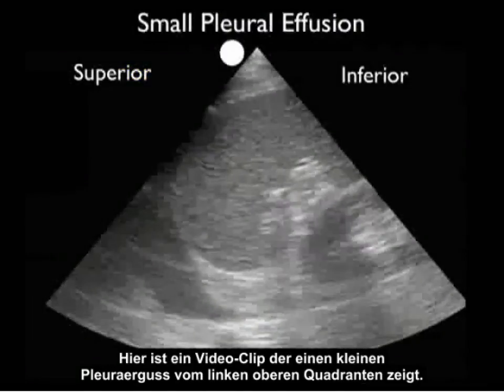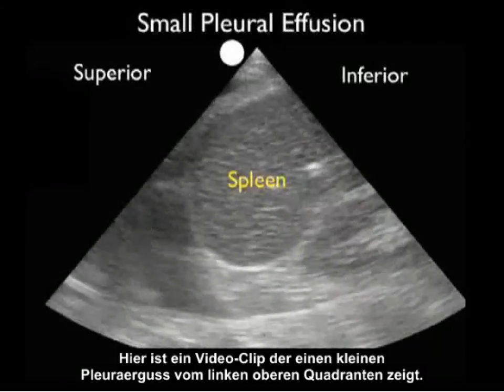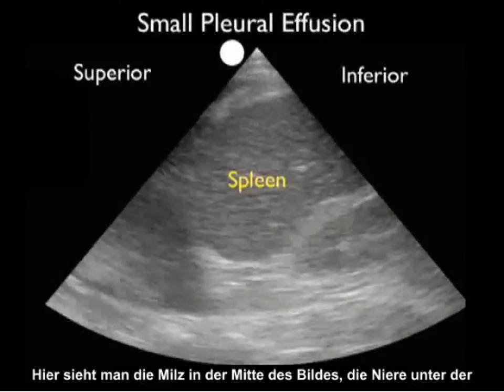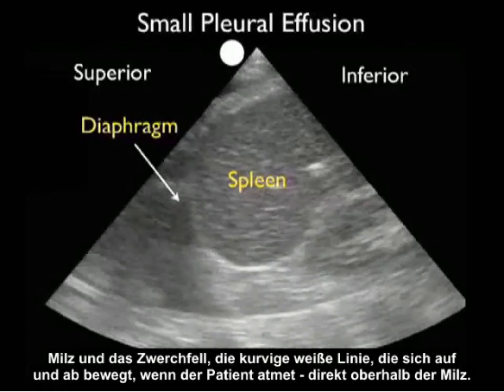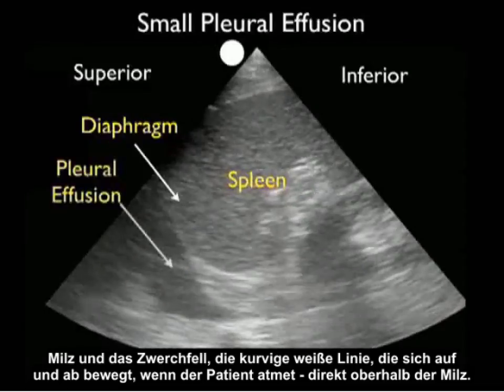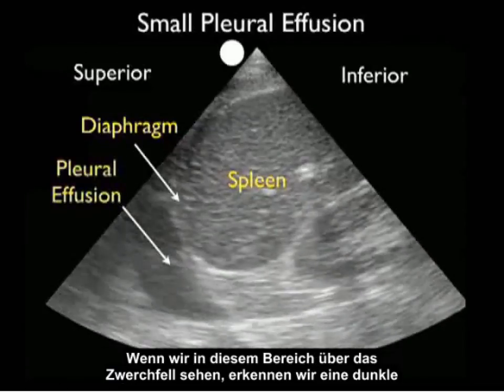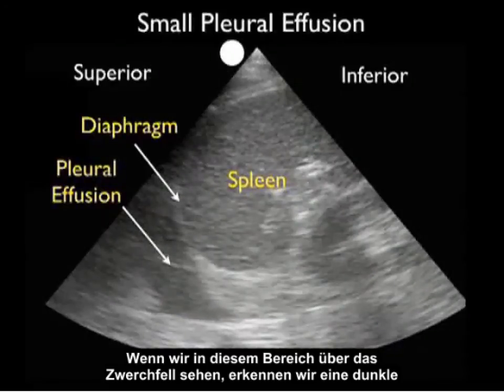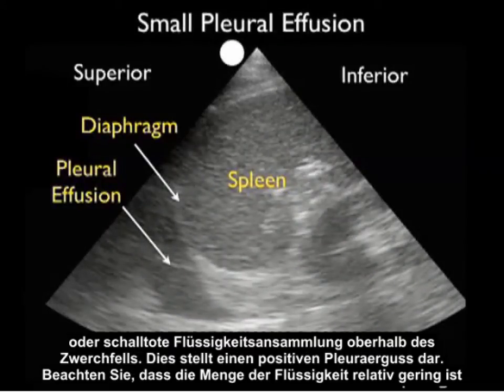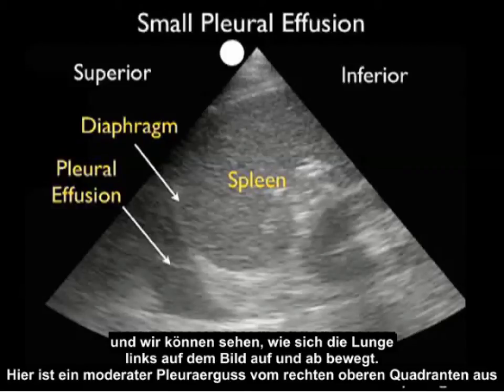Here's a video clip showing a small pleural effusion as taken from the left upper quadrant view. We see the spleen in the middle of the image, the kidney inferior to the spleen, and the diaphragm — the curving white line moving up and down as the patient breathes — right above the spleen. As we look into the area above the diaphragm, we appreciate the presence of a dark or anechoic fluid collection above the diaphragm. This represents a positive pleural effusion. Notice that the amount of fluid is relatively small, and we can actually see the lung moving up and down to the left of the image.